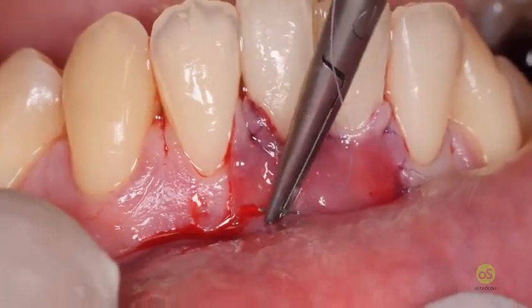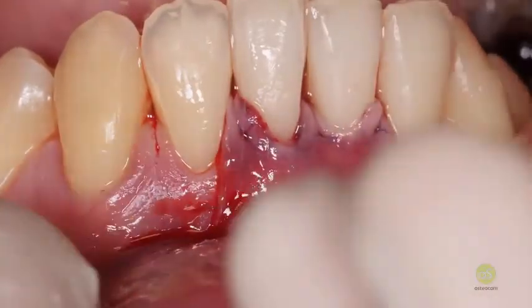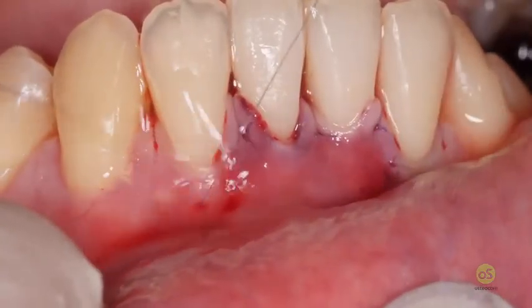So we fix here to the periosteum, to the adjacent soft tissue.